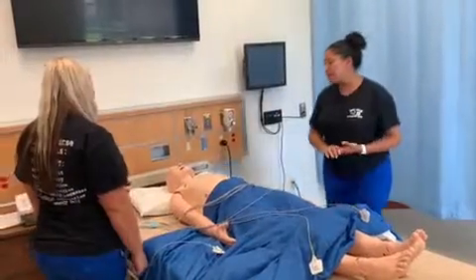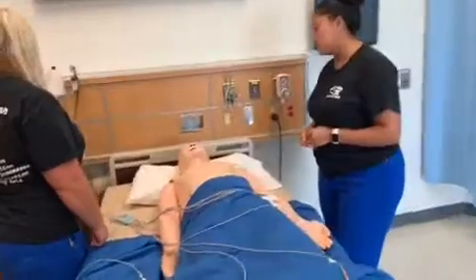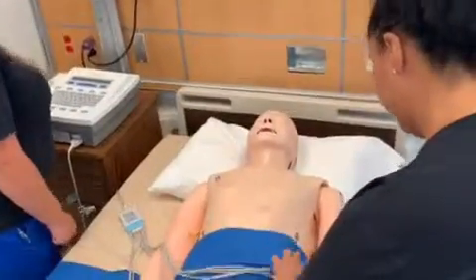Hey, Mr. Jeffries, my name is Sarah and this is Haley. We're nursing students and we're going to be doing an EKG on you today so we can get an idea of what your heart rhythm is. Is that okay with you? Yes, okay. So we're going to go ahead and get started.